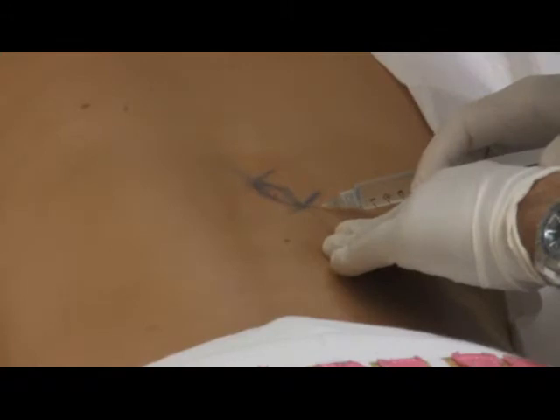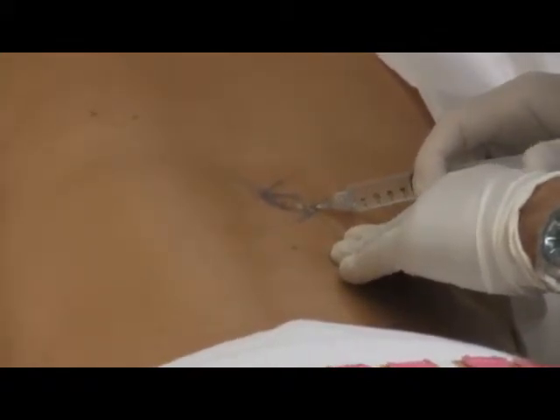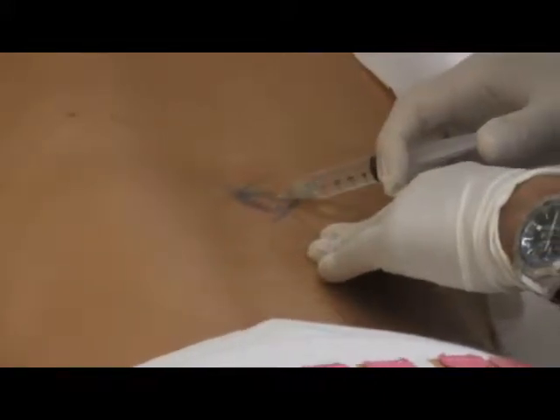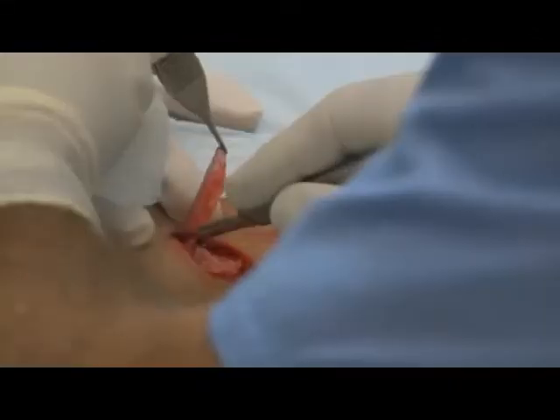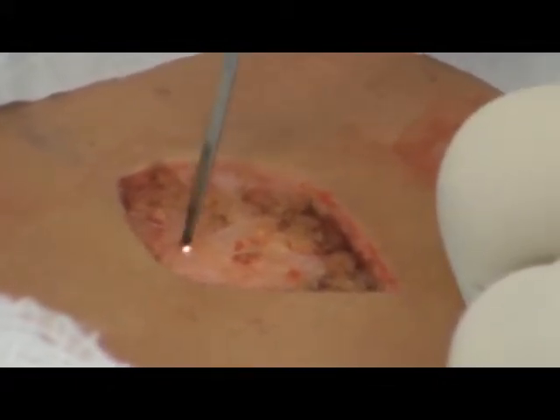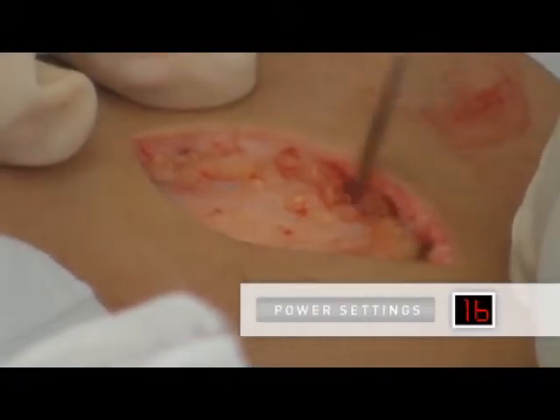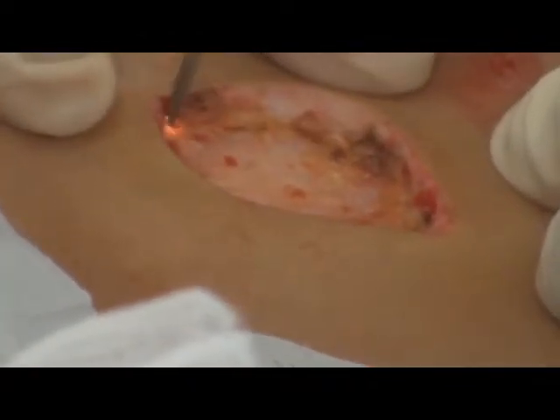The surgery site has been properly identified, prepped with an antiseptic antimicrobial skin cleanser, and local anesthesia has been administered. The surgery margins are marked, cutting into the dermis, and the specimen is removed. Using the ARIN 940 high-frequency desiccator by Bovee and an A804 sharp dermal tip electrode, any of the bleeding points resulting from the tissue excision are cauterized. With a power setting from 15 to 20, you can see how quickly and effectively the ARIN 940 accomplishes the hemostasis.